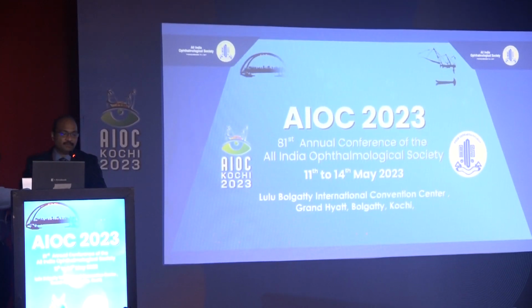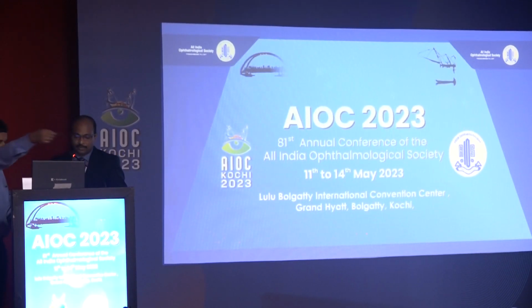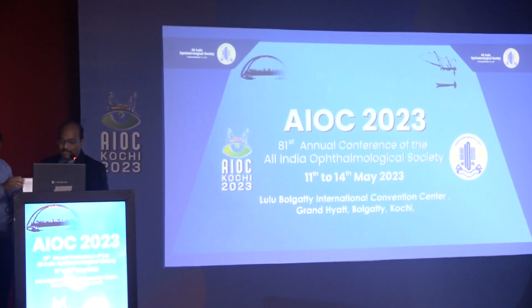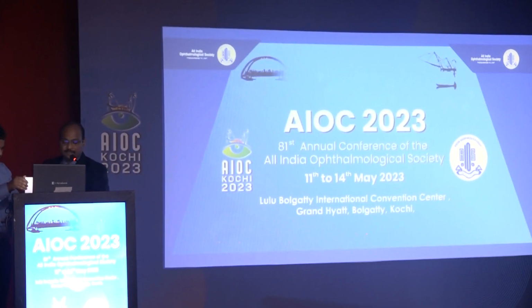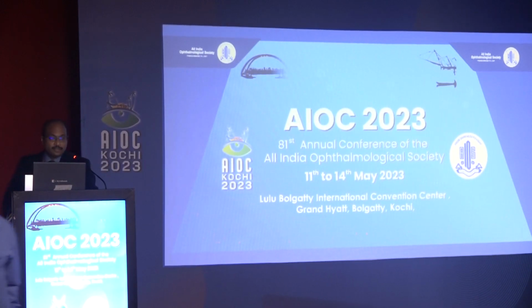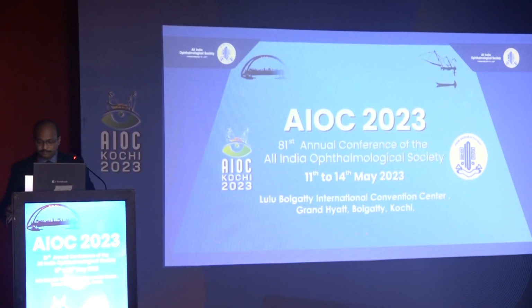So OCT is something that has taken the diagnostic world of retina by storm over the last maybe 1.5, 2 decades, and it's really become quite like what CT and X-rays are for a physician. Okay, so are my slides up?